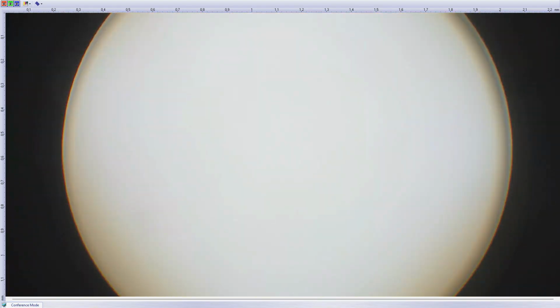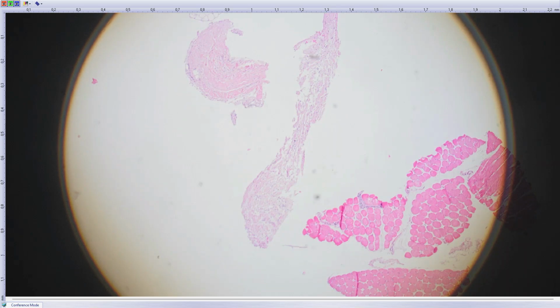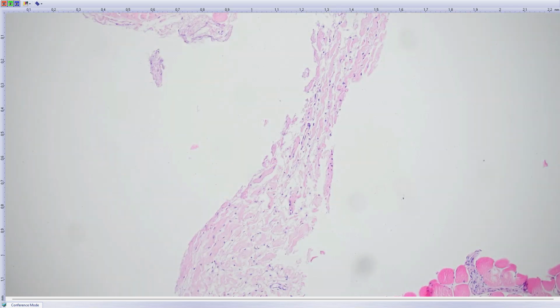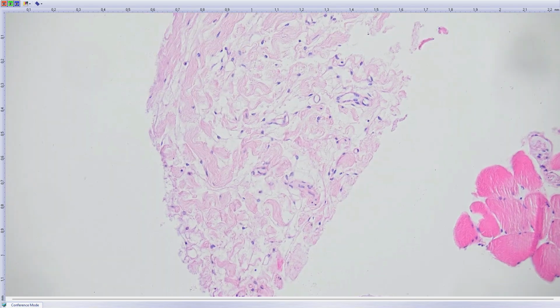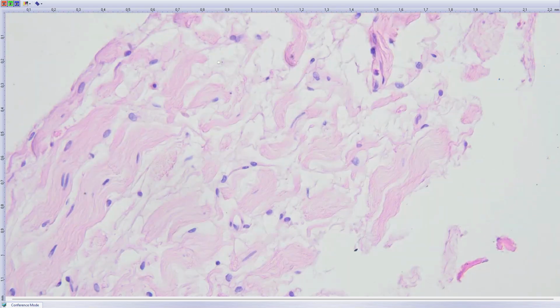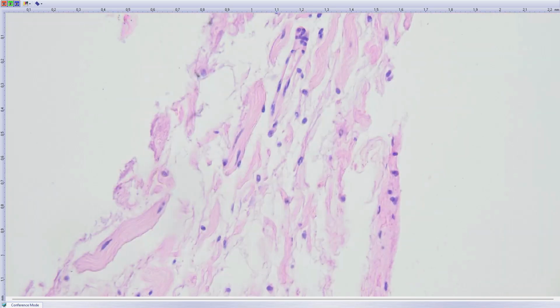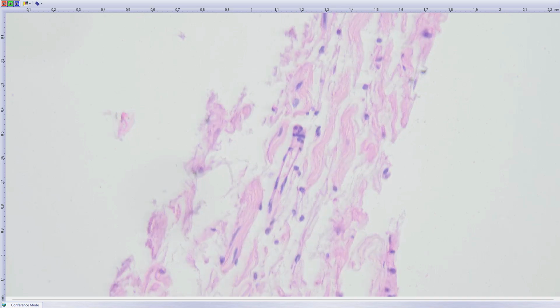There was one more block, but it didn't look much better than the one before. But this one fragment was the best we got. Again, very similar, hyalinized stroma, bland spindle cells. And then, perhaps more beautiful than before, these cells with long cytoplasmic processes here also.